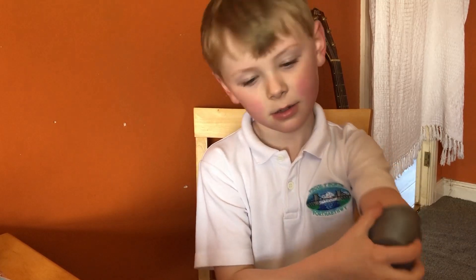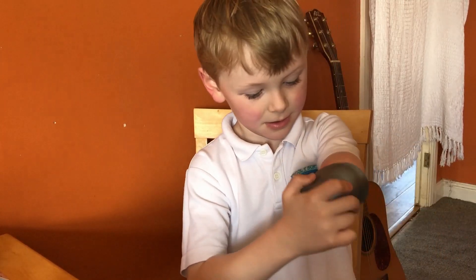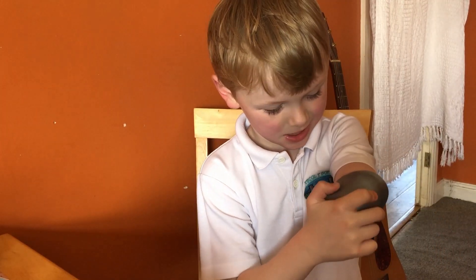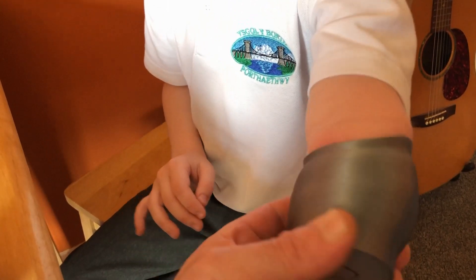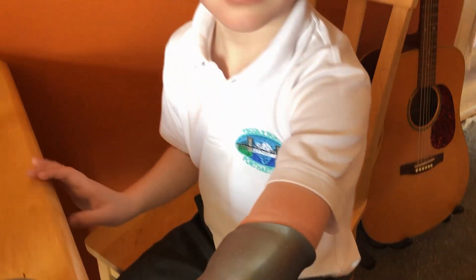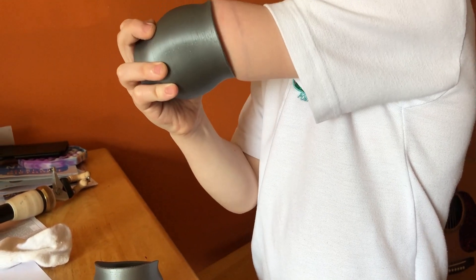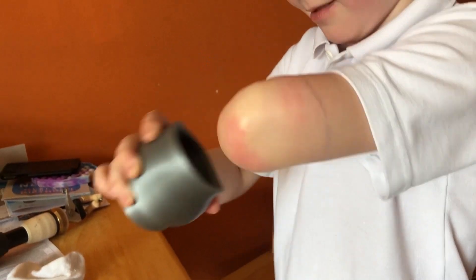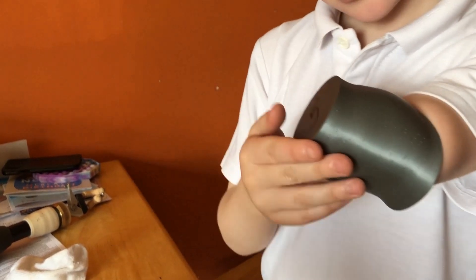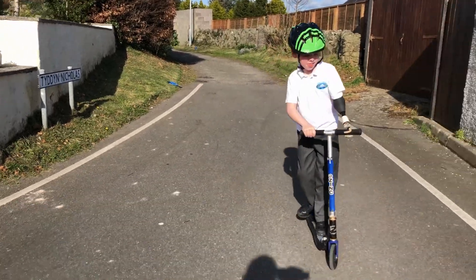We try the next one — this is number 5, the one made today. It sounds like it's a bit tougher to get on, but Sol says it feels better. Ideally you want it to go on snugly, not on or off too fast. It feels actually nice — and you've heard it from the man himself.